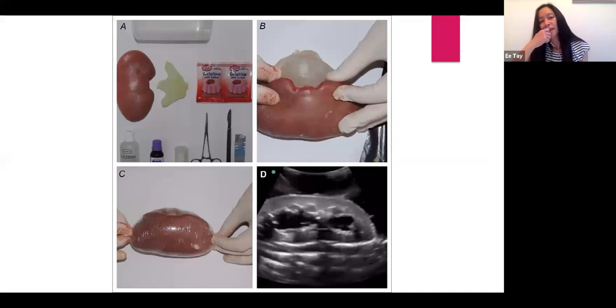And so if you wanted to look at what kidneys look like, somebody actually took, I think this is a pig kidney portion of it. And they got creative with the fingers of the gloves, and they made calyces with the dilated ureters, and then surrounded the whole thing with saran wrap. And then we're able to ultrasound it. Perhaps this is done under a water bath, or I can't really tell here. But you can actually demonstrate dilated, I guess, ureters or calyces and whatnot.